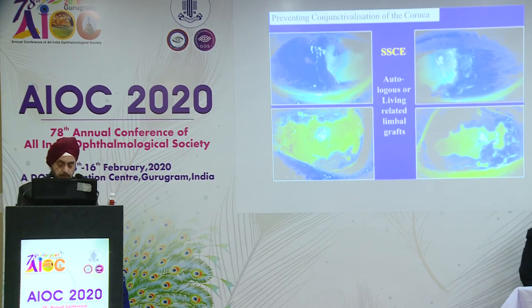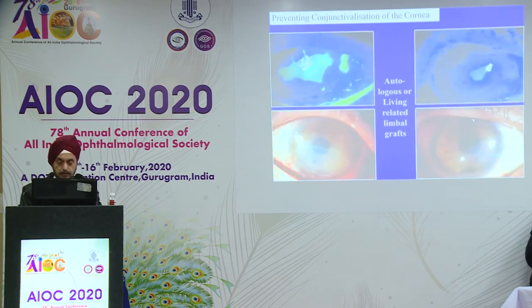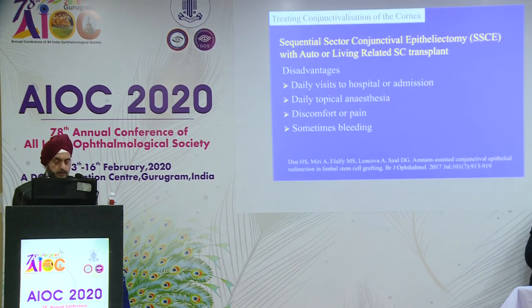So what you have to do is this SSCE: under topical anesthesia, keep scraping away these cells from here and here so that the corneal epithelium can move in a circumferential manner and repopulate the surface of the cornea. And you can see how once that is done, the conjunctiva cannot grow, it heals, and this becomes this, you get a very good outcome. But SSCE has certain disadvantages. You have to keep the patient in, you have to watch the patient daily, put topical anesthesia daily, and there can be some discomfort or pain and sometimes bleeding.